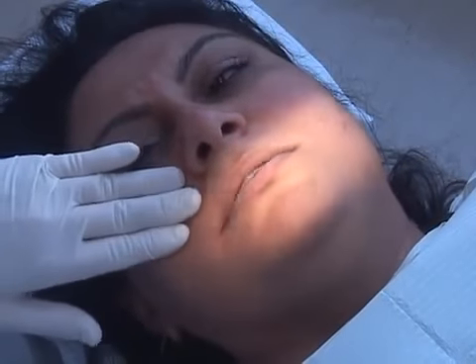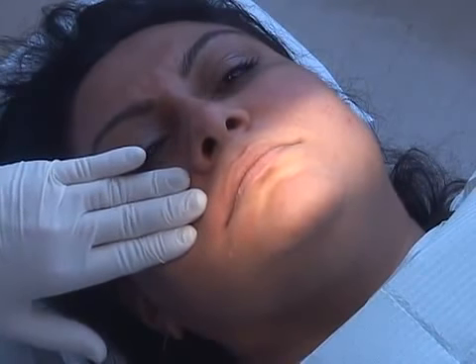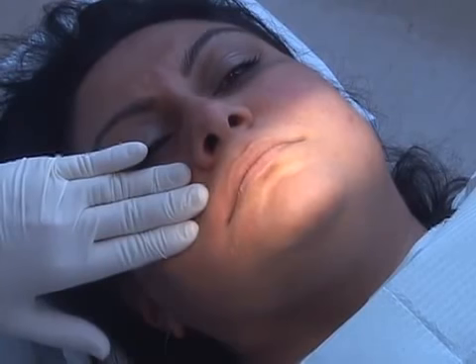Following deposition, slowly withdraw the needle and safely recap. Apply firm extraoral pressure over the foramen for 1 minute. This directs the anesthetic solution into the infraorbital canal to surround the MSA and ASA nerves that innervate the anterior and premolar teeth.